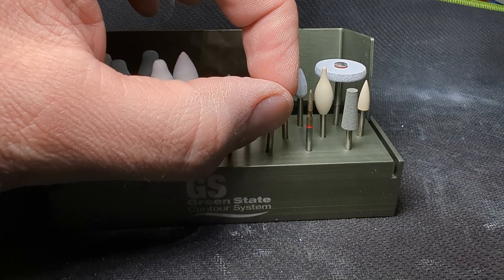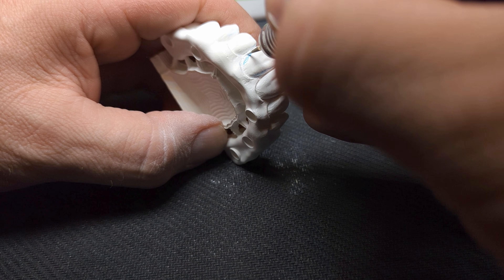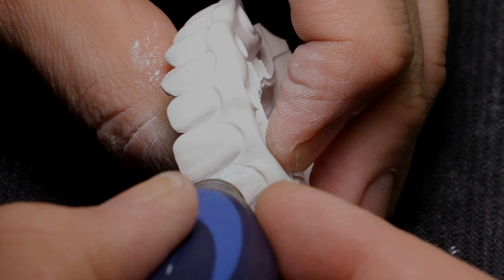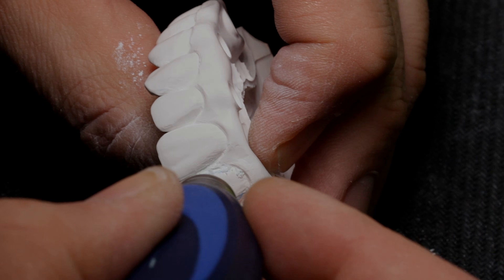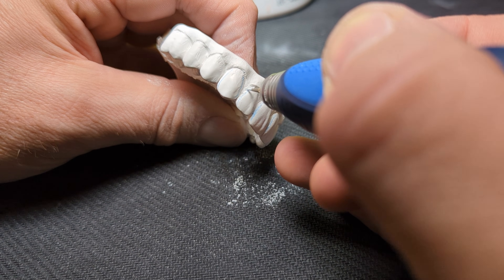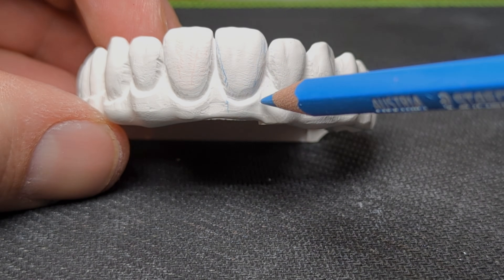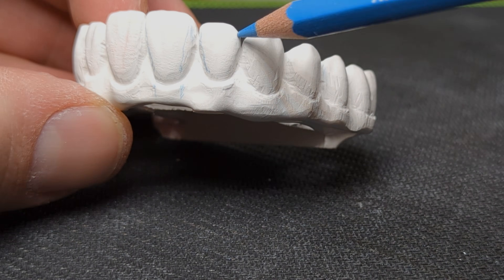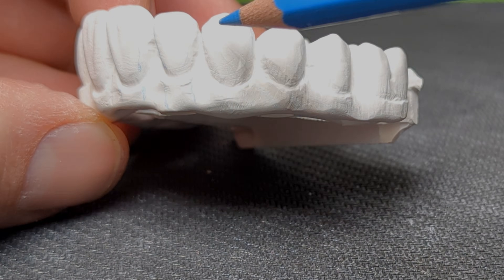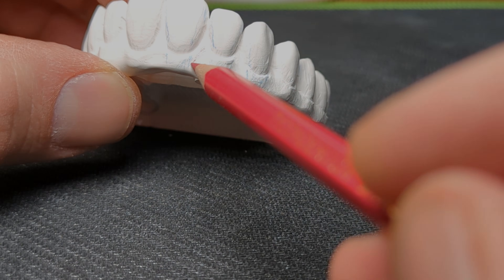I have seen too many technicians who cannot draw the changes they like to make, so I always ask them how they can use a burr to make those changes. Your zirconia contouring must be spot on when using Mio instead of porcelain. You can change little things later with the Mio structure, but your work will really stand out if you put the extra time to contour everything correctly in green stage.